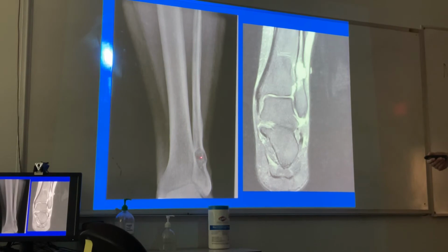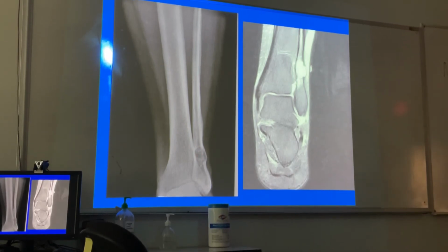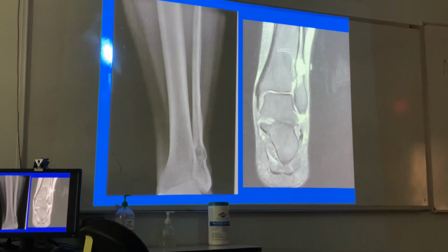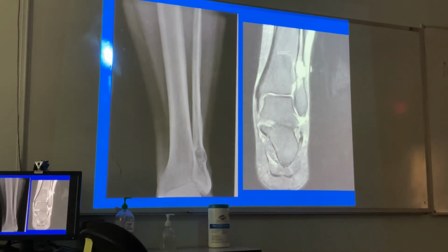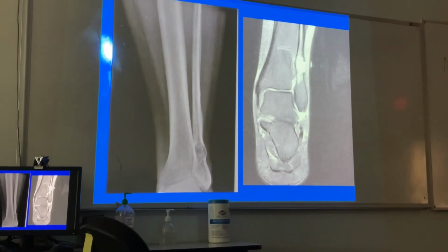Is there a difference between this radiolucency where the laser pointer is now and this one in terms of size? Yep. Fuzzy says yes. What say you? Is there a difference between this and this area?